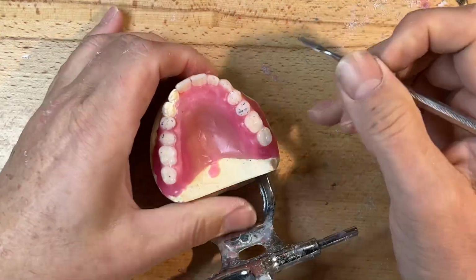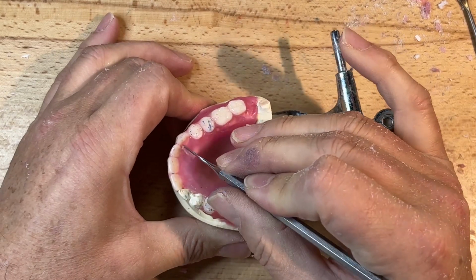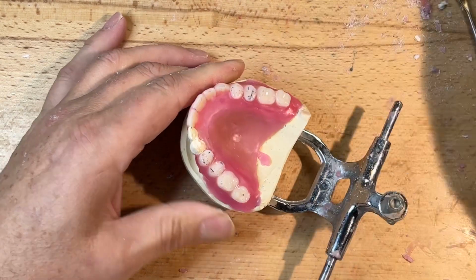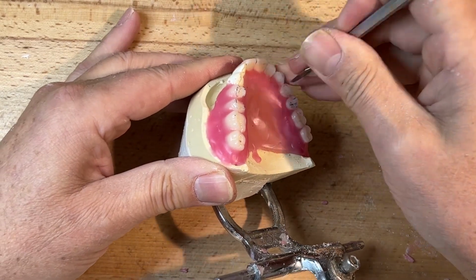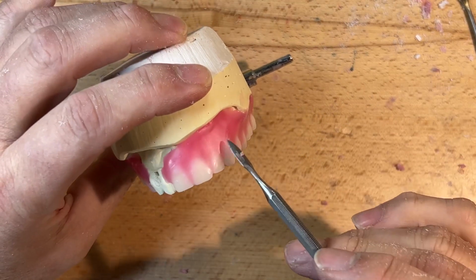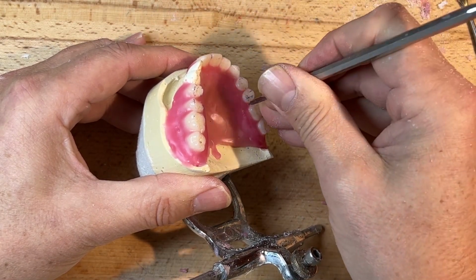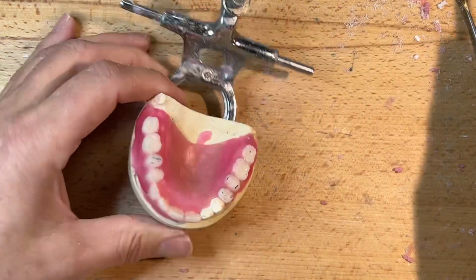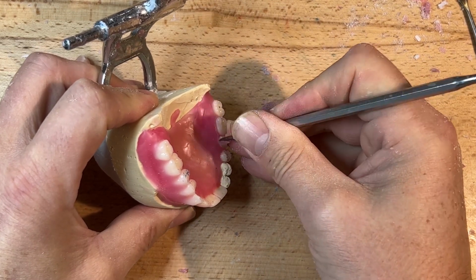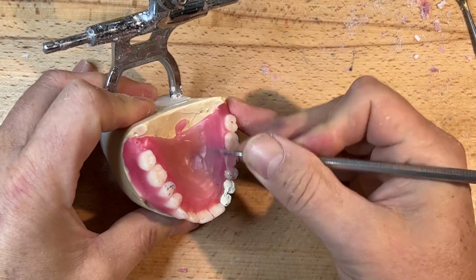I'm going to expose the full lingual anatomy, the centrals, the 2-2, and the canine. The canine I may leave fuller on the lingual because this denture tooth anatomy is a little bit weaker, because I've chosen to keep the labial gingival emergence of that canine a little out to frame it a little bit better. And I don't have the strength of the lingual to fill in there from the denture tooth manufacturer.